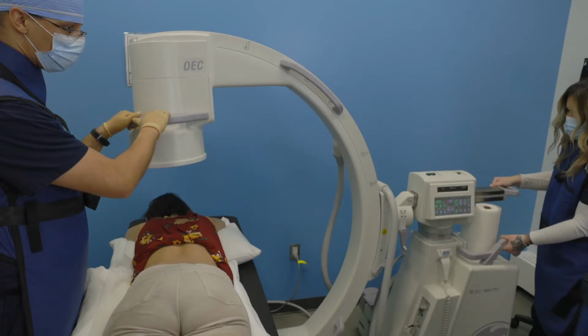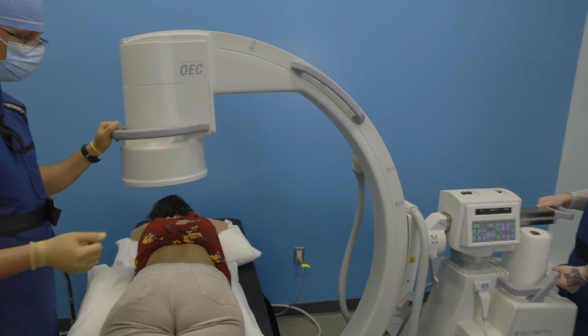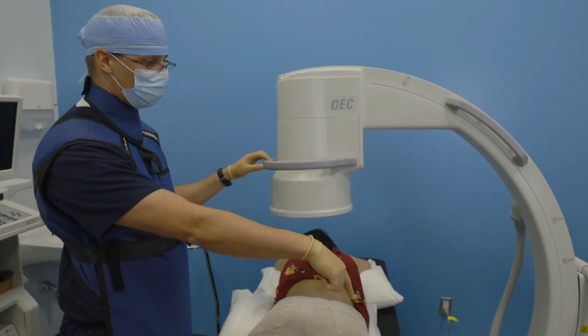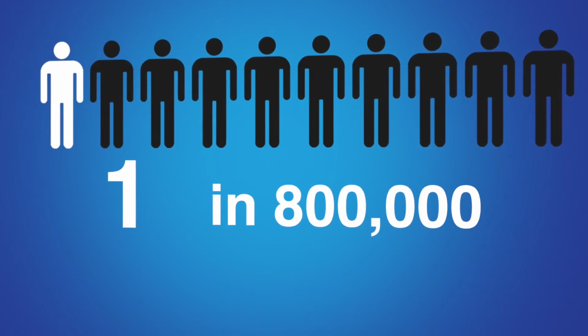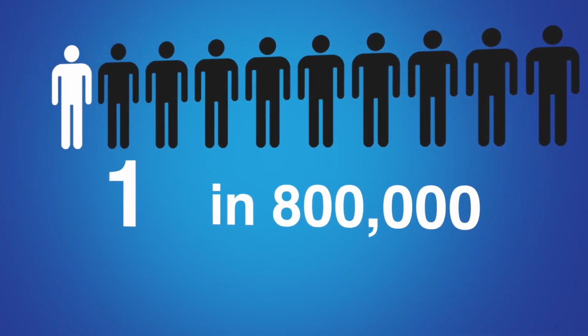For patients getting epidural steroid injections, there are a few specific things you should know. Epidural steroids are injected into the space between disc and nerves, not in the spine itself, and this procedure is done with the guidance of a mobile X-ray machine called the C-arm. It is impressively safe with a risk of serious complications between 1 in 800,000 and 1 in 2.3 million, which makes it statistically safer than driving a car.